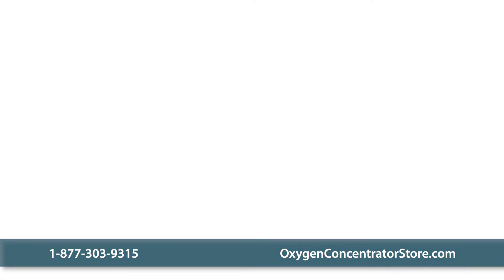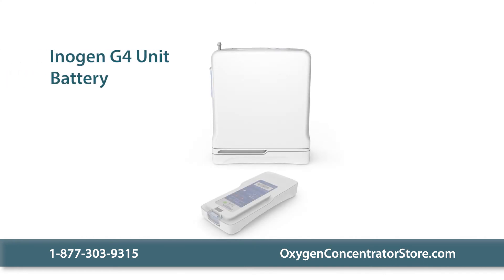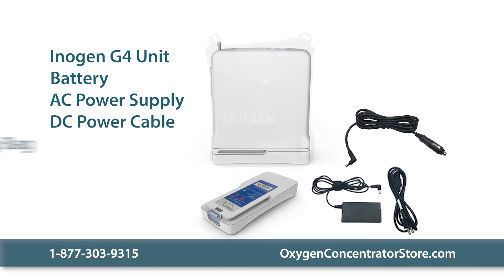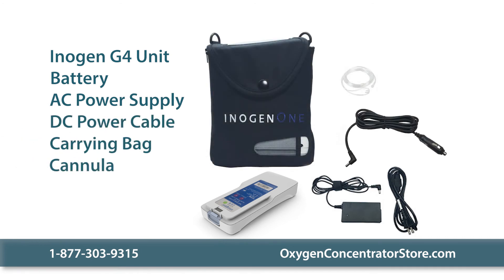Your order includes the Inogen G4 unit, a single battery, an AC power supply, a DC power cable, a carrying bag, a cannula, and a manual.